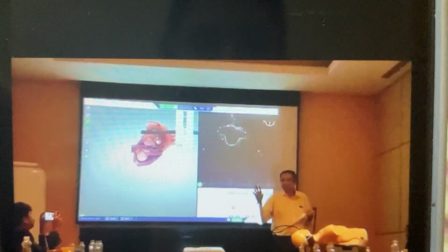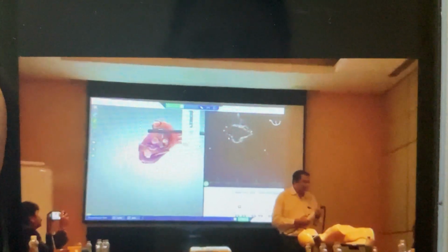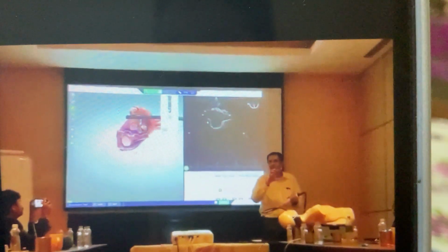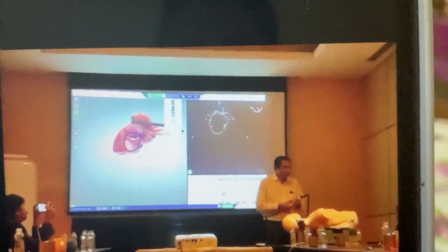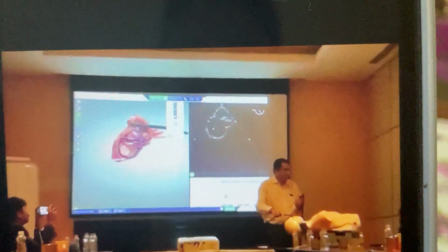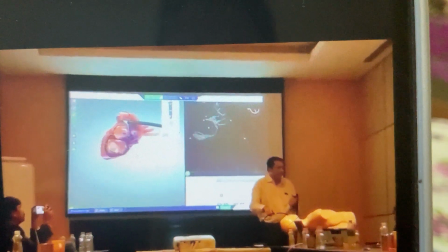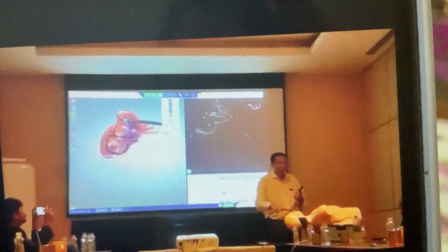From here I will go to 75-80 and go towards the right and push the probe inside. I will get the IVC with Eustachian valve. Then I go to 90 further and I get the bicaval view, where I get some part of the SVC, some part of the IVC, RA and LA. Furthermore, I go to 100, 110 also and I pull out the probe till RPA and I see the whole of the SVC.